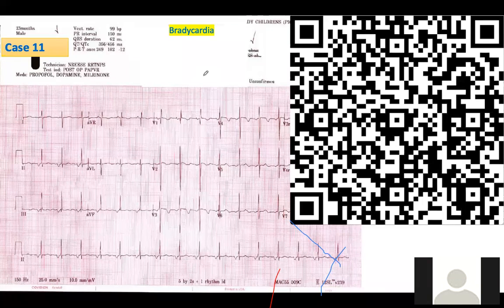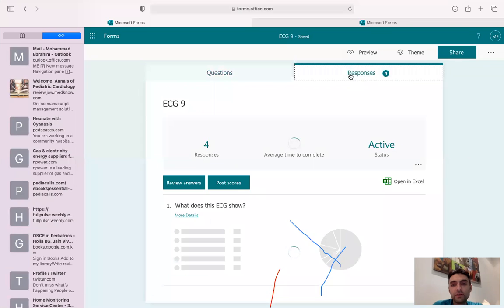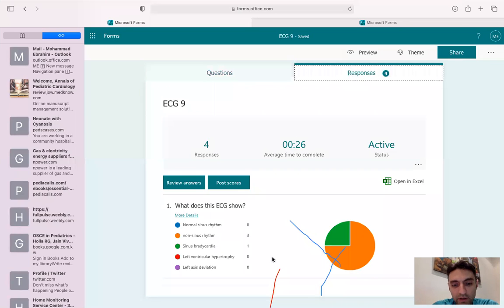Yes, yeah. Okay. Yalla, only 4. Okay, so it's something non-sinus.